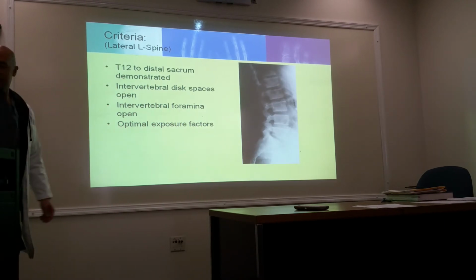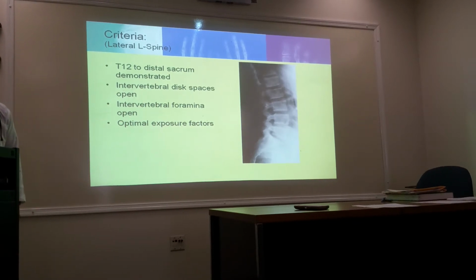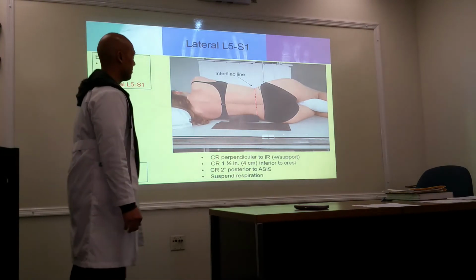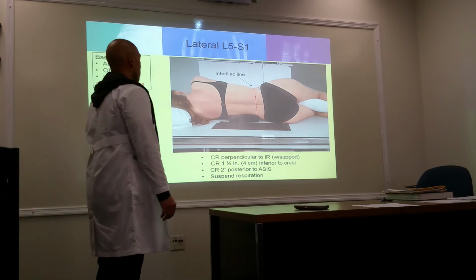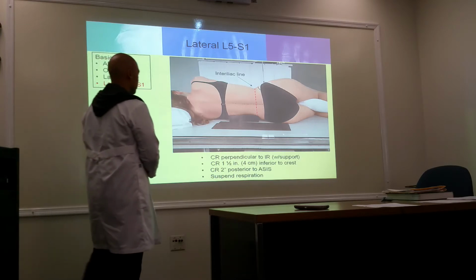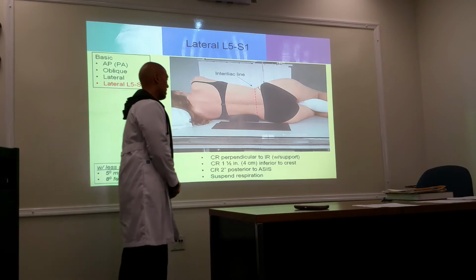Okay. What do we say on expiration? Okay, on expiration. L5S1. So now L5S1. From the lateral, your central ray will be now 1.5 inches below the crest.